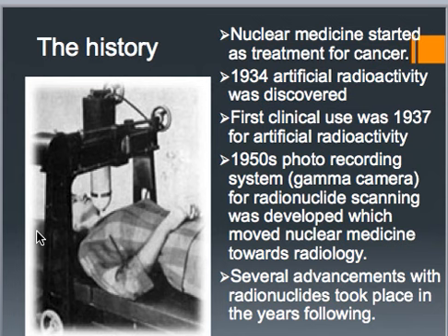Several advancements have taken place over the years that have followed, and they continue to improve. There are still new advancements in nuclear medicine. Today, whereas they started out with basically just imaging the thyroid, there are over 100 different nuclear medicine imaging procedures, which provide an image of nearly every organ or system possible.